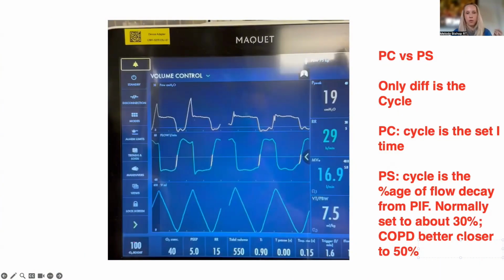at its fundamental core with SIMV, because you are now having two different breaths with two different cycling mechanisms, trying to match those two is very, very difficult. So you are literally varying the level of support breath to breath. And the brain cannot predict what level of support it's going to get, so it's going to predict based on the last breath. So then it's like, I didn't get a long enough inspiratory time in that pressure support breath, the next breath I'm going to work harder. So then it works harder.